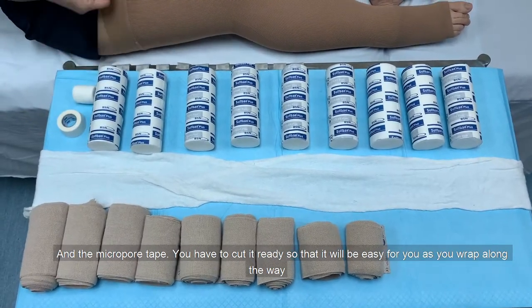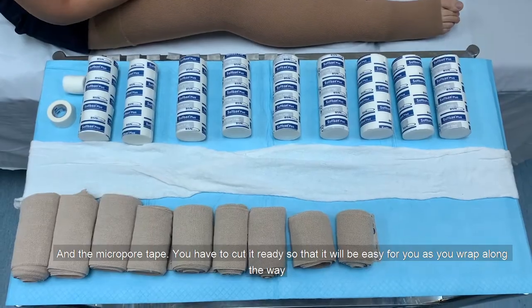You'll also need micropore tape. You'll have to cut it ready so that it'll be easy for you as you wrap along the way.